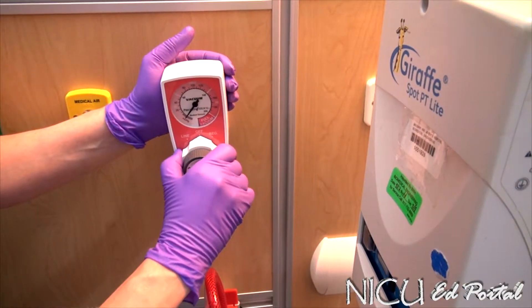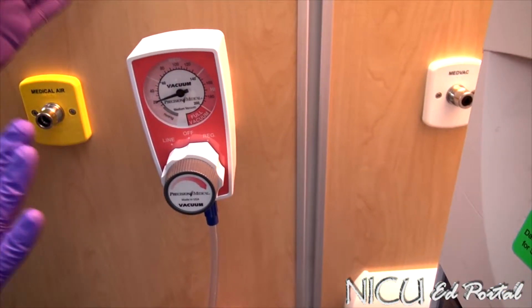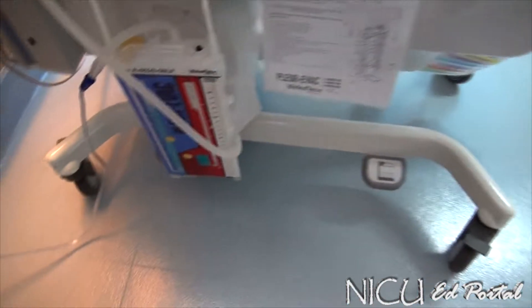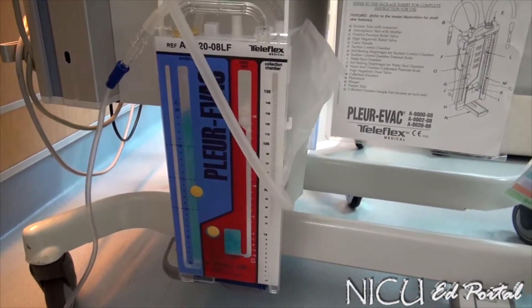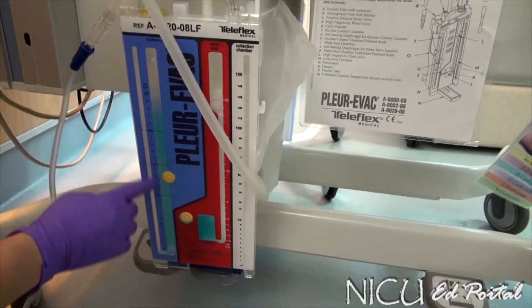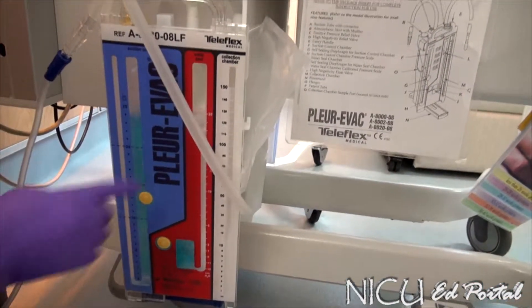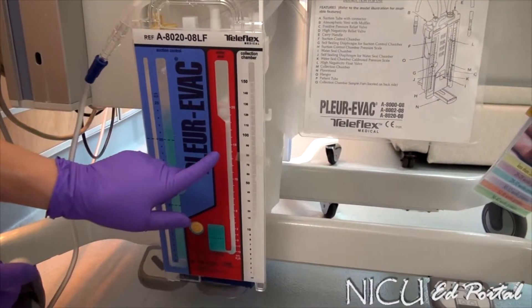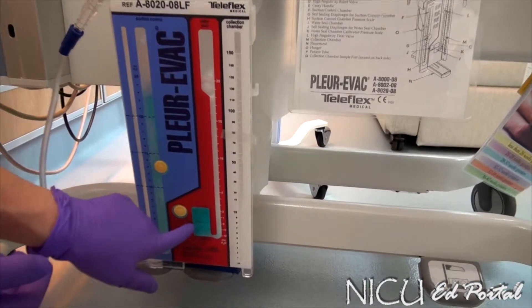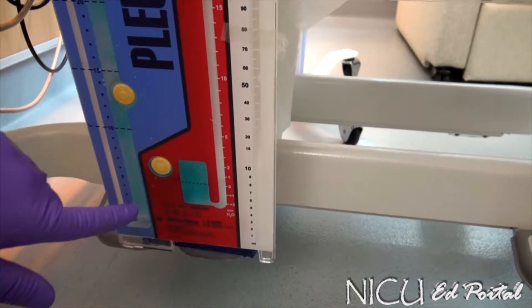Now that we've connected the drainage system, we're going to turn on the wall suction. The suction amount on the wall is not really the control — it's the centimeters of water suction that you have put in, which the provider is ordering. I had this at 20. What you can see, going back to our chambers, is a nice rolling bubble in the suction control chamber. We also have a very present pneumothorax — this is air that's bubbling and being evacuated. Make sure the provider and team know you have an active pneumothorax.